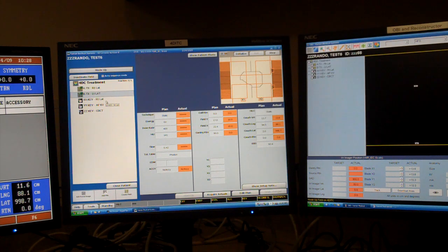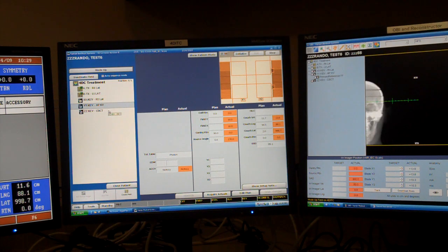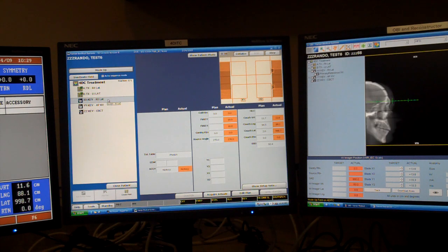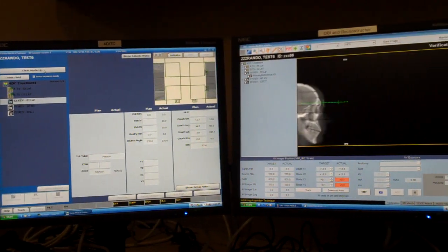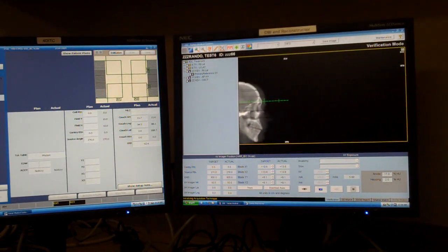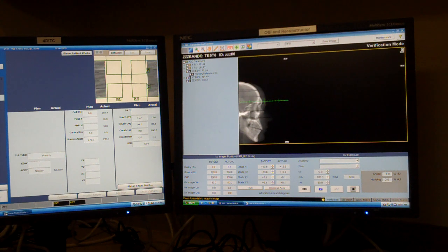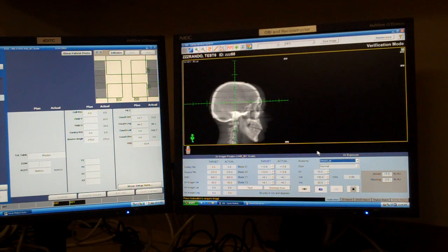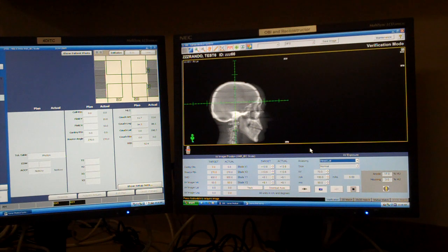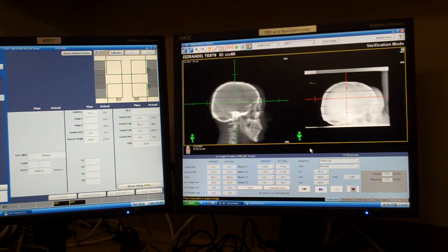Now I have my treatment fields, my KV images, and my Conebeam CT. I'm going to start with the right lateral and select that. I click Mode Up. My gantry is already at 0 degrees, so I don't need to do anything. For my anatomy, I'm going to select a head lateral. The presets work very well. I press the thumb switch and it takes an image.